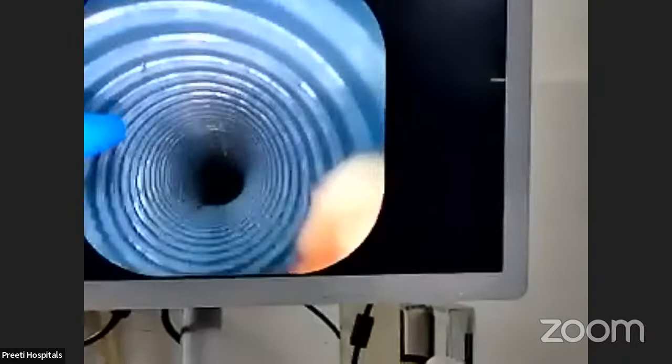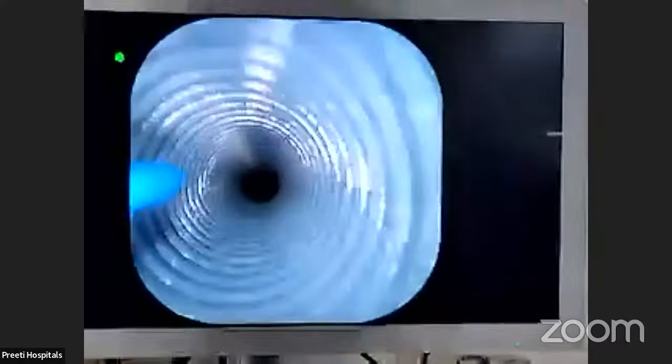They have to be sucked out. So there is no doubt that the only thing is that you have to be slow like this. 45 centimeters you have to come out. They will come out from the exit. Unless he flushes, the water will not develop the pressure. That's why suction should be, see, now I came out. So you immediately go. And immediately see how much time it took. 10 seconds. 10 seconds you are there. But during that time, nobody should move the access sheath badly.